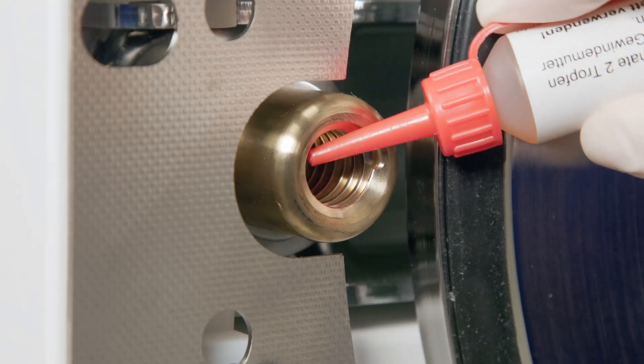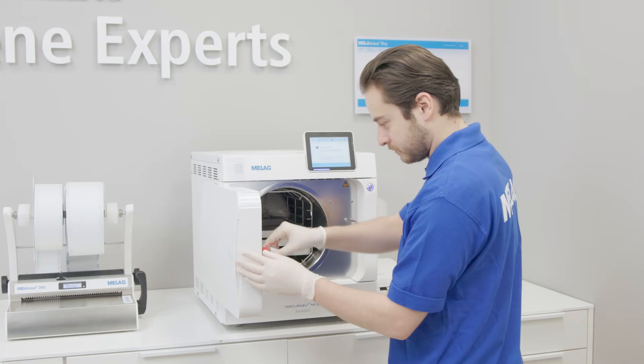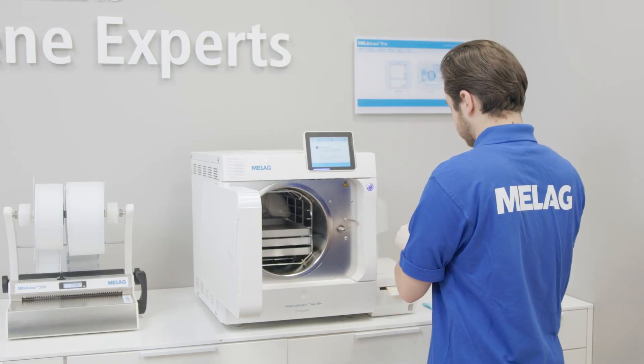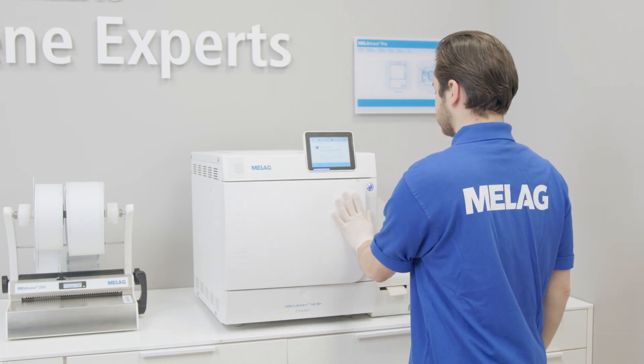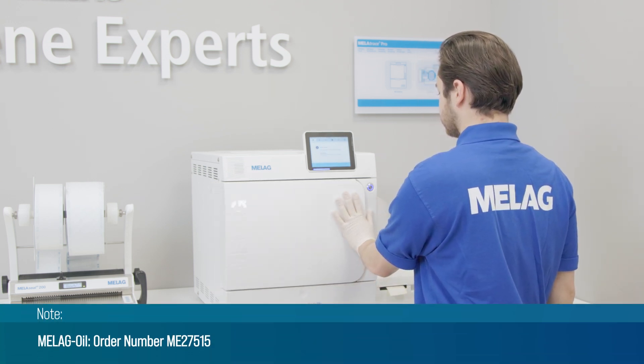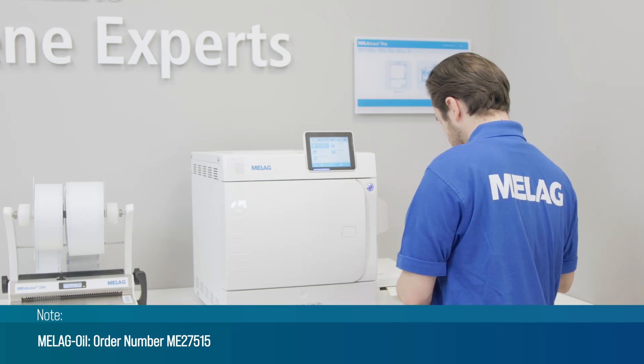To care for the door lock, add two drops of MELAG oil directly to the lock nut. When the door is closed, the oil is automatically distributed evenly, ensuring that the lock functions smoothly. Use only the original MELAG oil for maintenance, and contact your service partner if necessary.